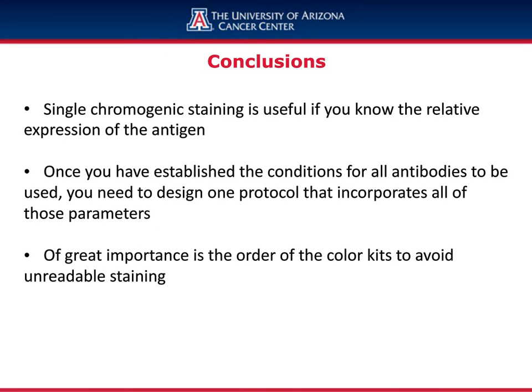staining. In conclusion, single colorimetric staining is useful for single antigens, but once you've established the conditions for 3 antibodies or 4 antibodies, you need to design one protocol that takes into account all those parameters.